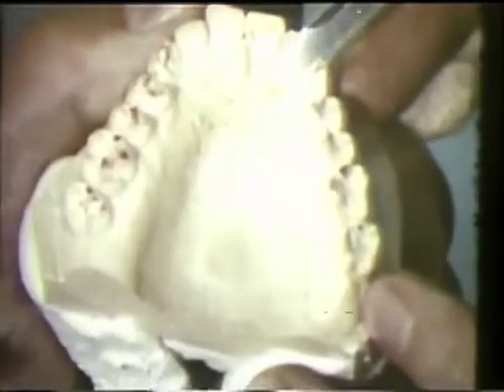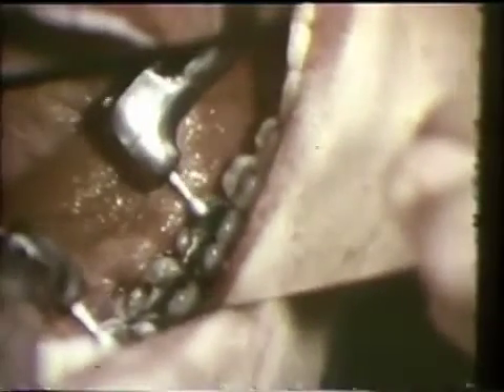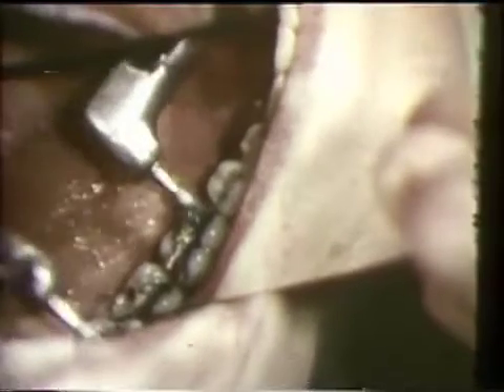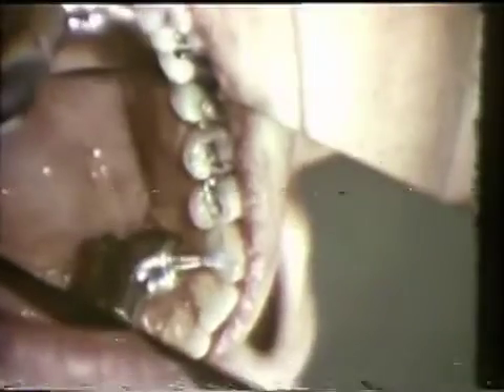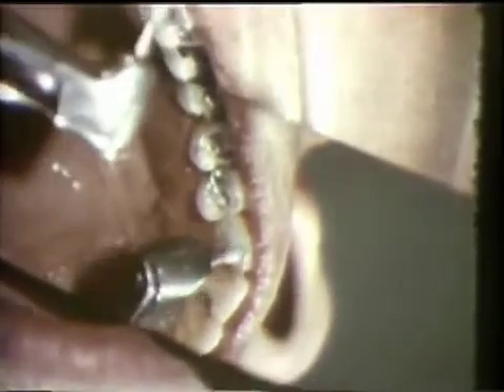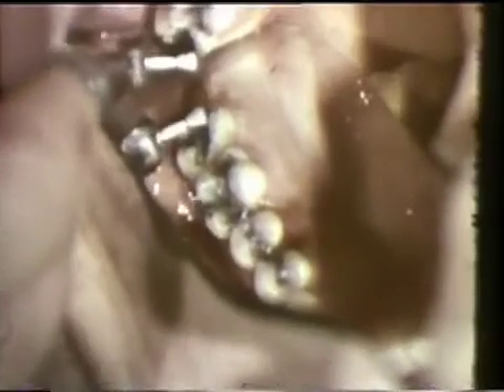A ledge on the left cuspid is reduced to provide a smooth gliding movement in lateral excursion. Grinding in the mouth follows the same pattern. The buccal incline of the distolingual cusp of the mandibular first molar is reduced. Then the ledge on the left maxillary cuspid is eliminated. Notice that the initial and end contacts on the cuspid are left undisturbed. The heavy balancing contact on the buccal incline of the lingual cusp of the maxillary right second molar is eliminated.